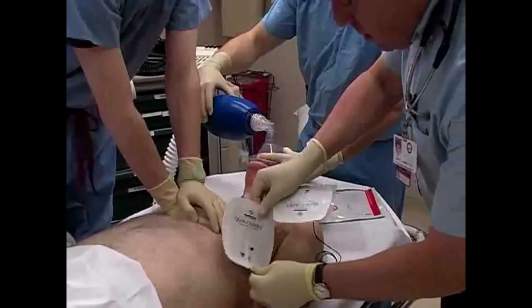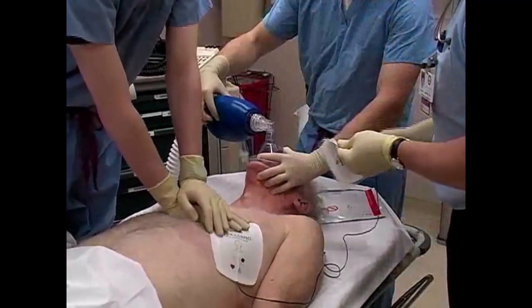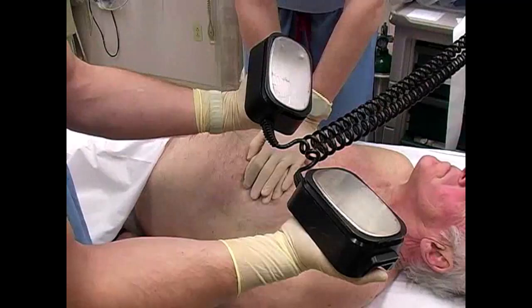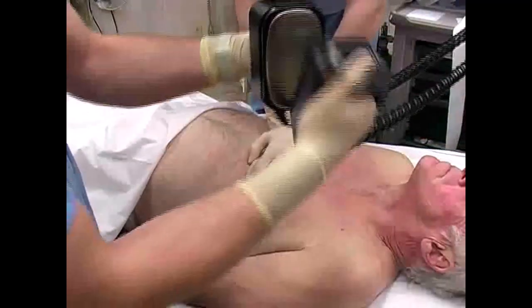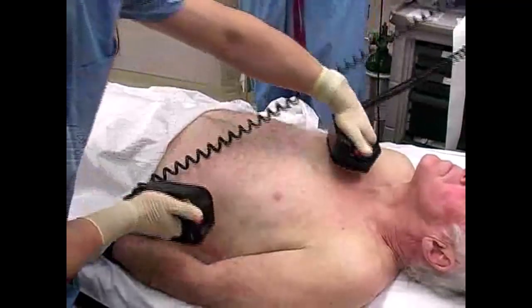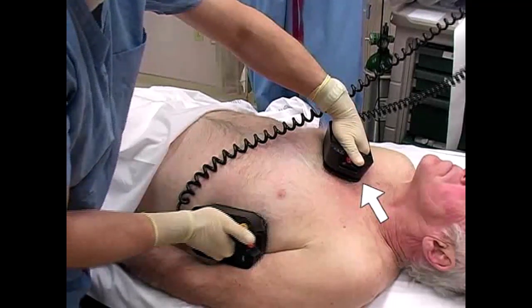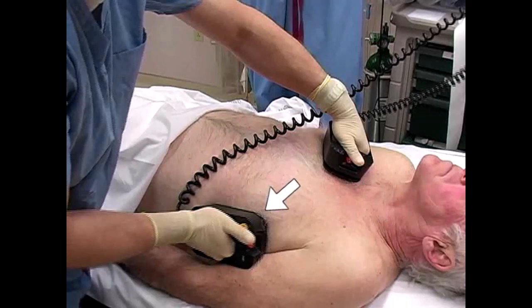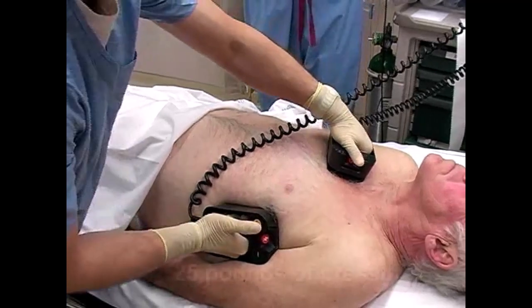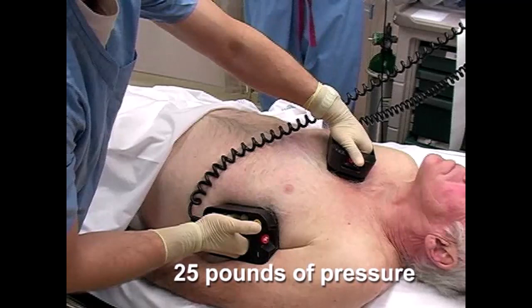Self-adhesive defibrillation pads are preferable for delivering countershocks, but if they are not available, the defibrillation paddles may be used instead. First, apply electrogel and distribute it evenly along the surface of the paddles. Place the anterior paddle to the right of the sternal border at the second or third intercostal space and the lateral paddle in the left mid-axillary region at the fourth or fifth intercostal space. Press down with about 25 pounds of pressure to ensure adequate contact between the paddles and the chest wall.